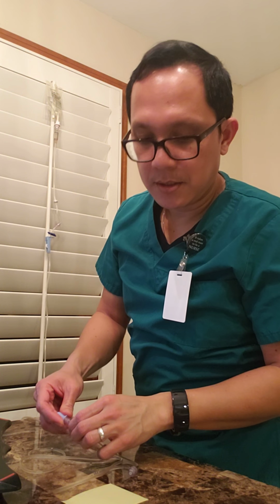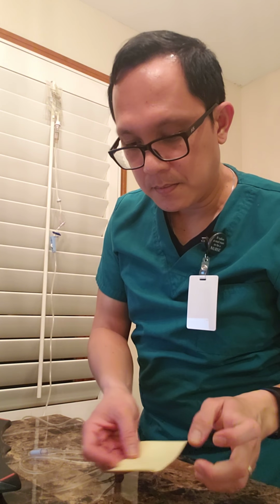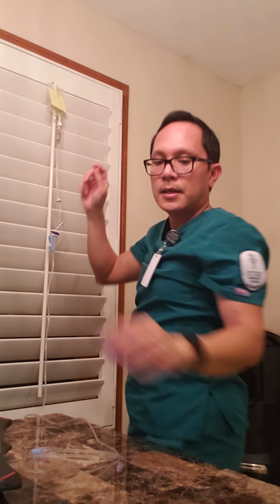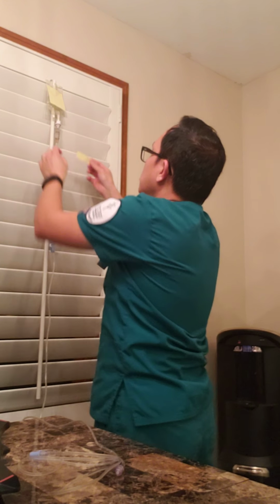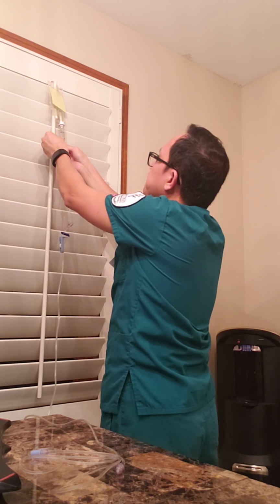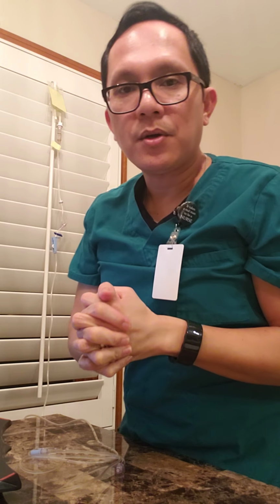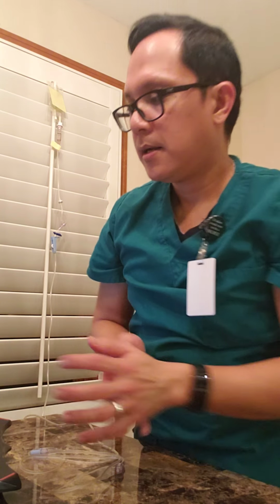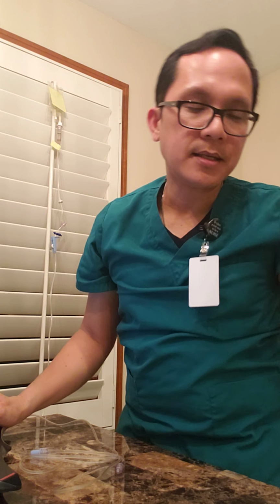Before I go to my patient's room, I want to make sure I put the time tape on my bag and the tubing label just below the drip chamber. And before I go to my patient's room, I make sure I dump all the trash or the supplies in the proper receptacle, perform hand hygiene, and log off from the computer or the system.